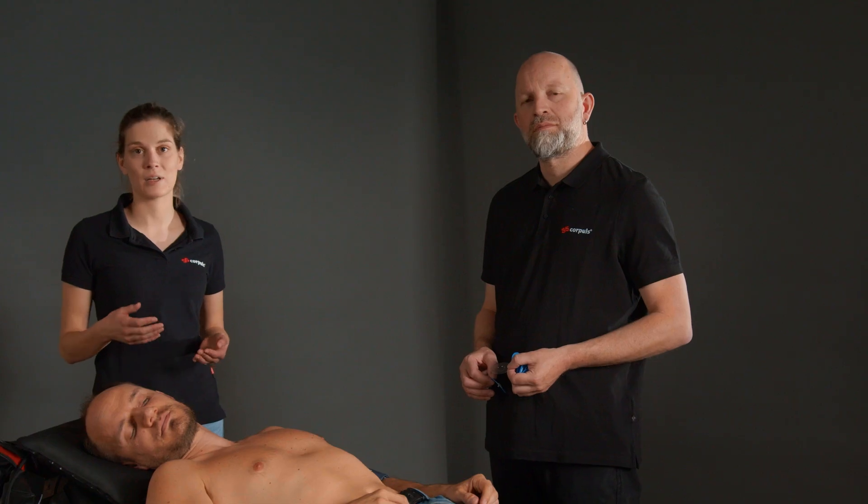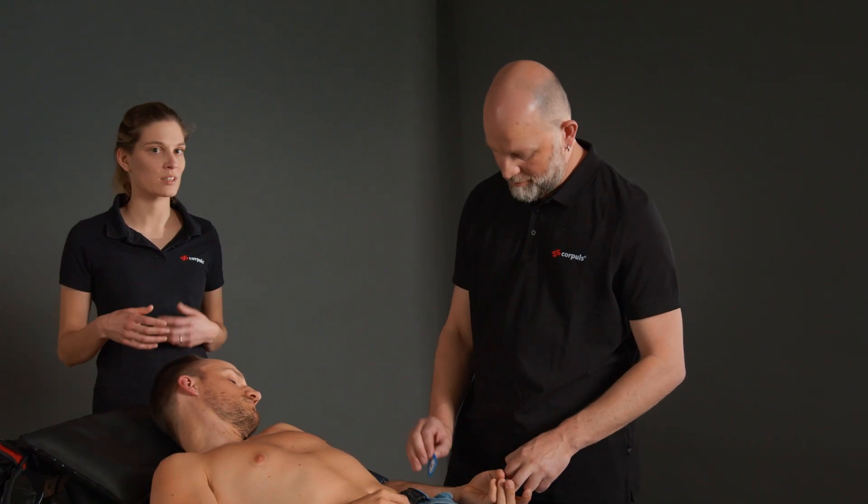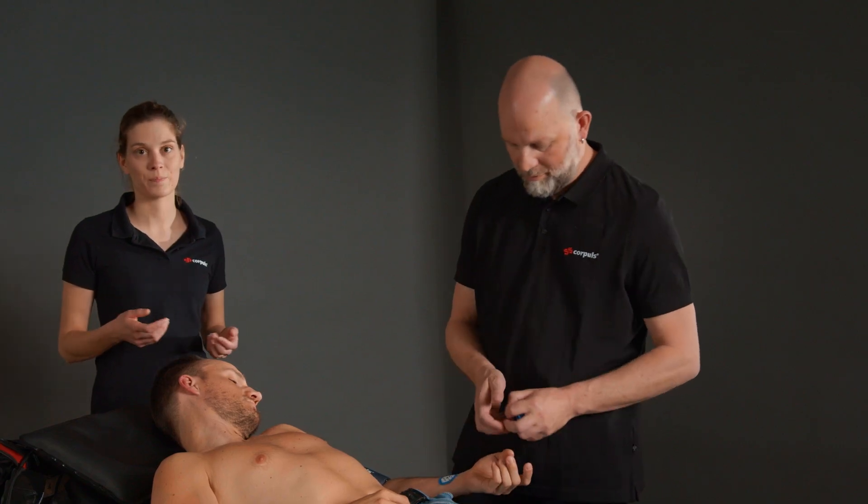When doing a diagnostic ECG, it is important to ensure that the electrodes for the extremity leads are attached to the extremities. They should be as distal as possible and not on bones.